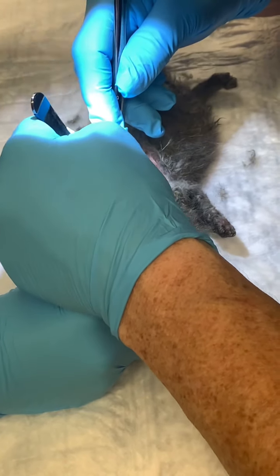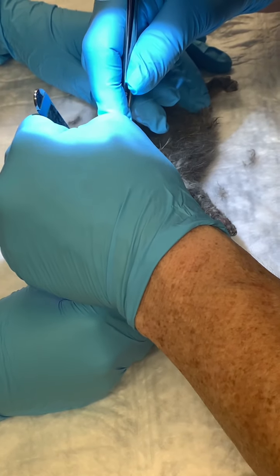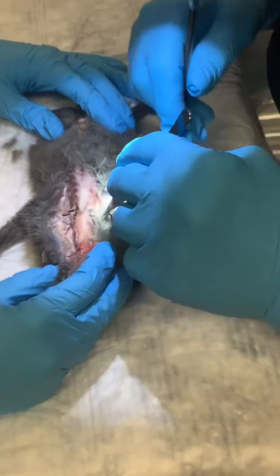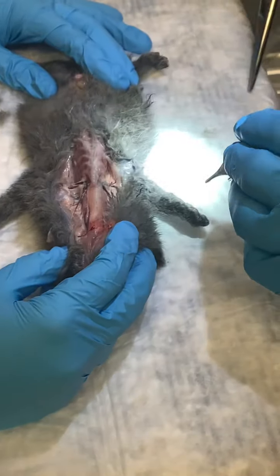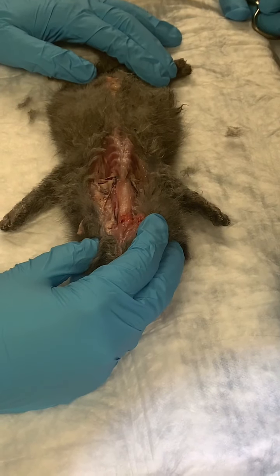It's going to be a little tough. The suprascapular lymph nodes are going to be a little hard to find. If they're too small, I just need a general area where they should be. Do you have to identify the heart? Yep.